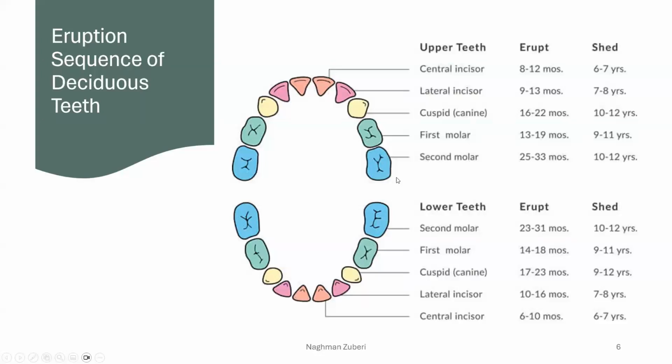Then the lower second molar, from the 23rd to 31st month after birth, and the maxillary second molar, from the 25th to 33rd month.